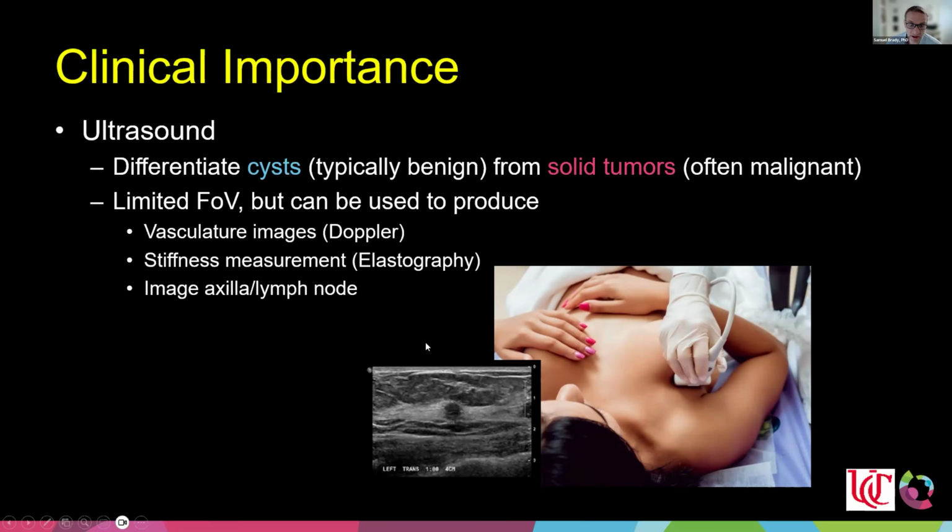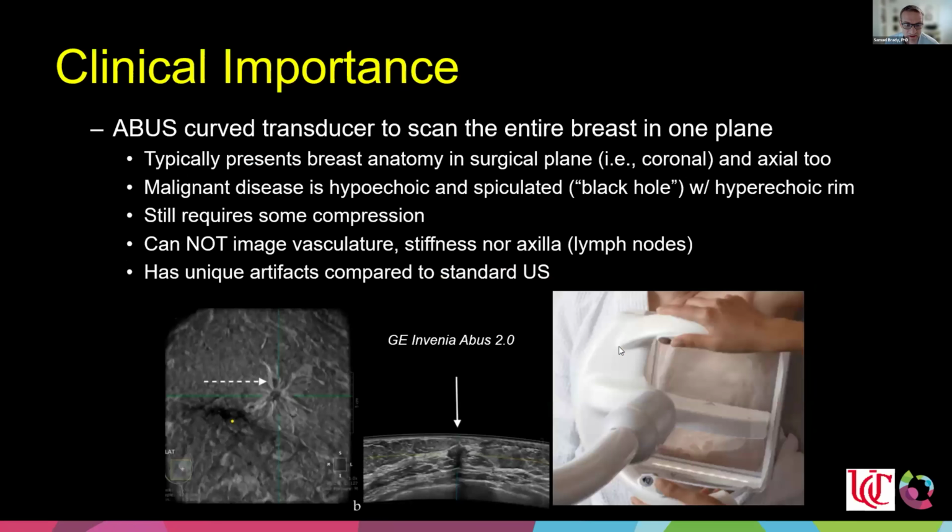But the downside of traditional ultrasound is that it is a relatively small scanning area. And so it does require a certain level of education as to how to image to be able to find the disease.